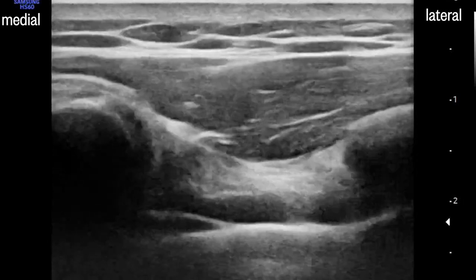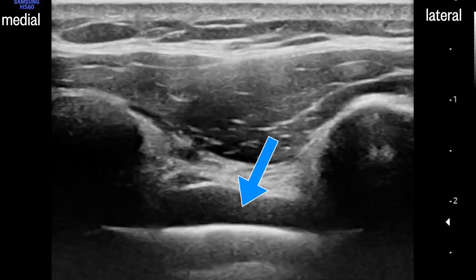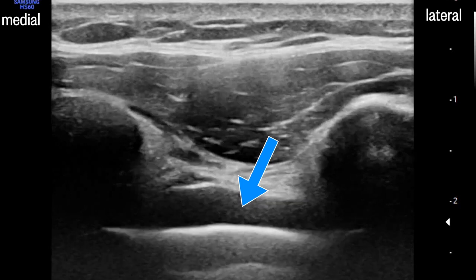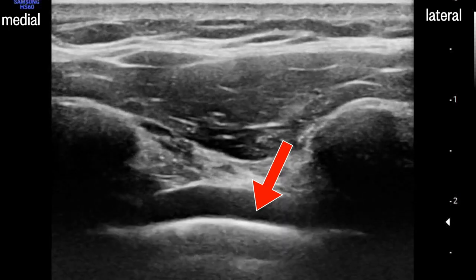If we rotate 90 degrees to the parasagittal orientation, we see a nice view of the cartilages and a dark area next to the pleura which almost looks like a nice target for intercostal block. This is the internal mammary vein. Shifting the probe laterally brings up the pulsatile mammary artery, and then back to the vein again.